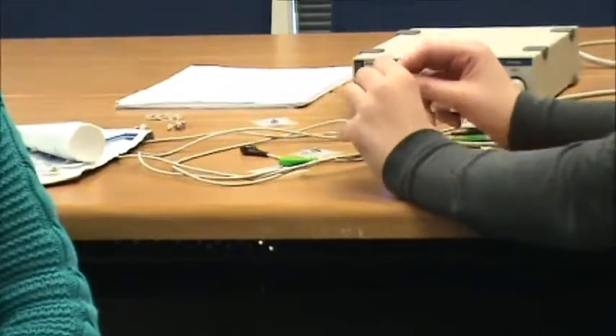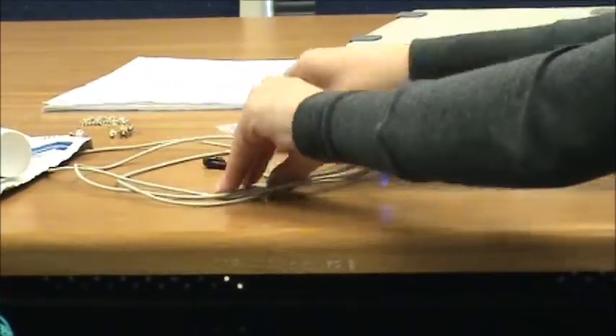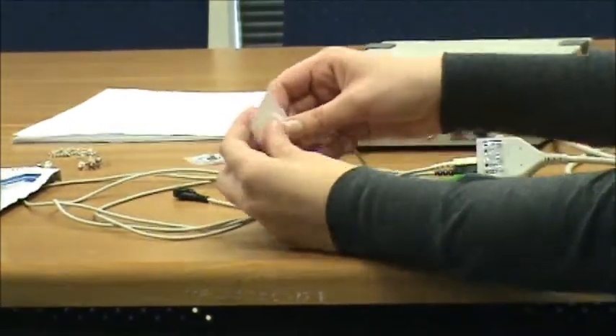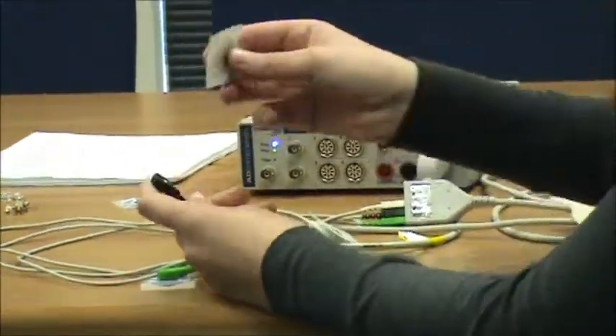Next we're going to put the leads on. All these leads contain a salt solution that helps to pick up an electrical signal for the power lab. Also, these are the same leads that are used for an EKG.